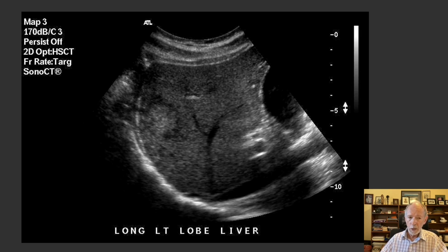Now, while the speckle pattern of the soft tissue is not in itself meaningful, the average intensity is meaningful because it represents a genuine tissue property. If I have abnormal tissues within the liver, as I think we probably do in this case, then you'll see different brightness at some points. And that's genuine. That tells you that those tissues have different scattering properties. Commonly, increased scattering properties may be related to fibrous degeneration, fatty infiltration, or other processes of that sort.